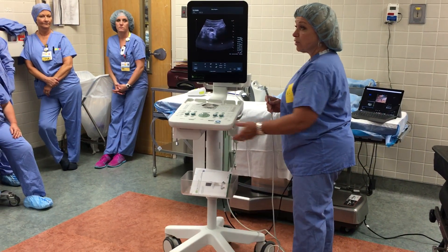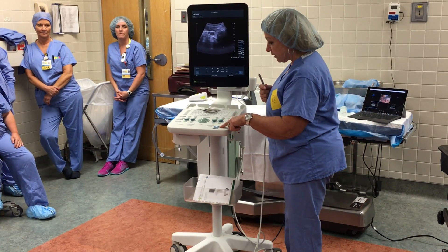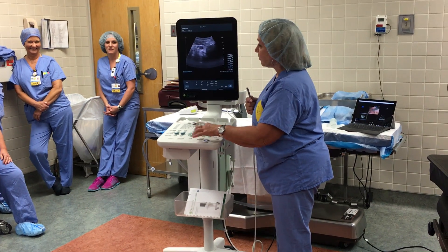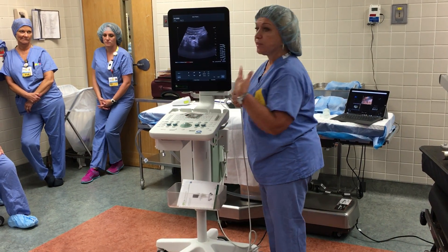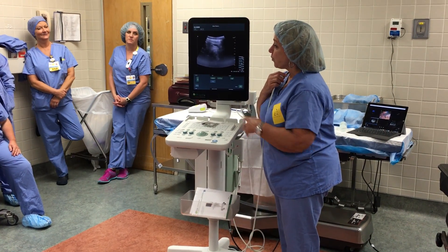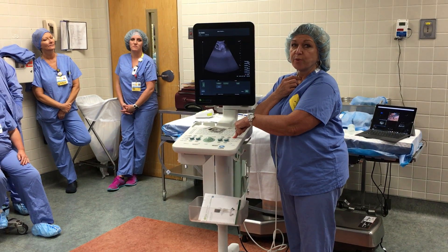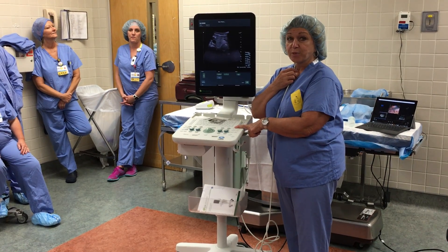Do they ever annotate into the images or measure anything? When it's measured, you have to hit freeze first. Hit the measure button — you have a cursor, bring it up, put it where you want it, lock it in with select, bring it across, hit select again. You can do every measurement with the measurement button — over six measurements. When you unfreeze it, they all go away. Our presets are really good, and if you want to go back like Dorothy, hit the home button for two seconds and you're right back where you started. You can never mess up.